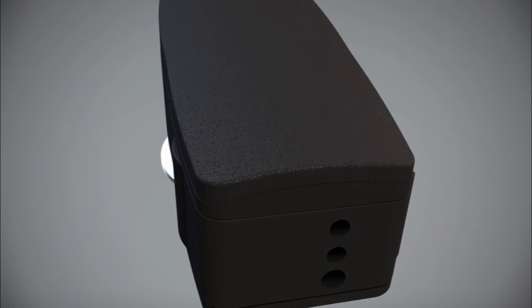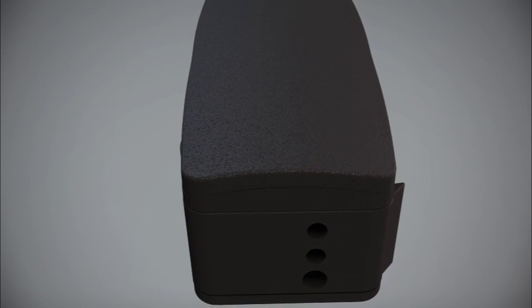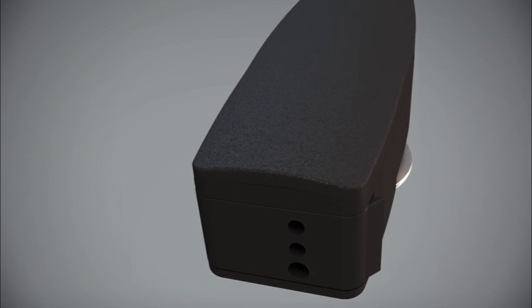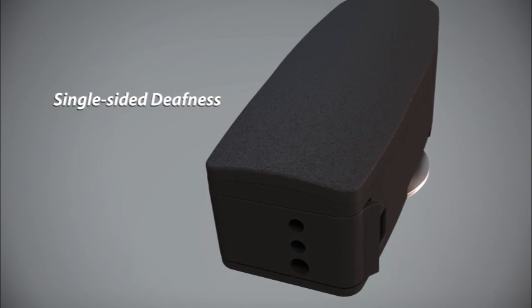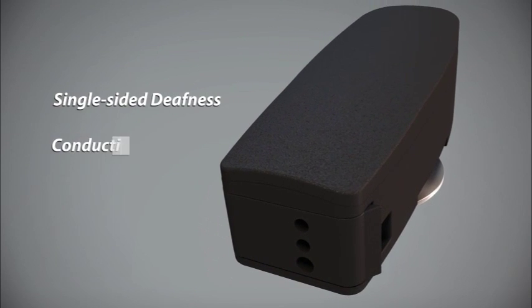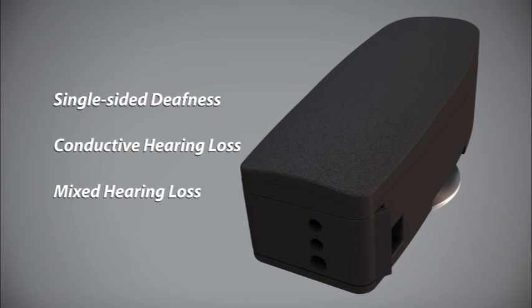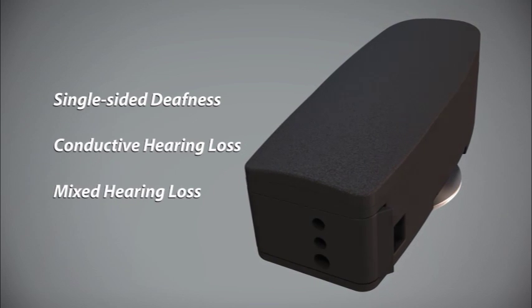The Sifono Bone Conduction System is the premier solution for patients with single-sided deafness, conductive hearing loss, or mixed hearing loss.